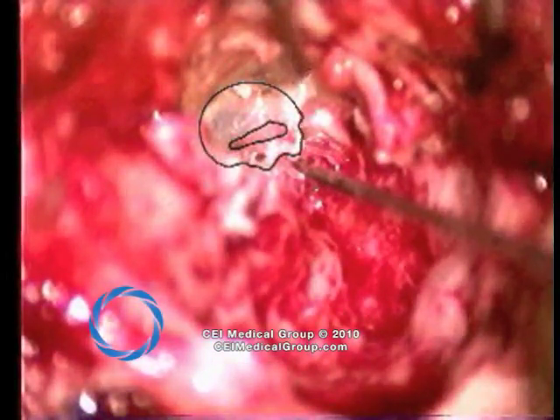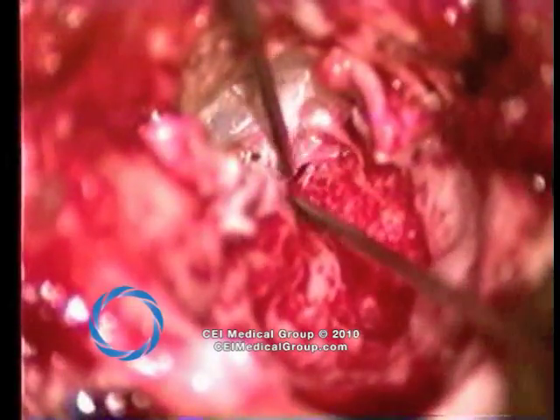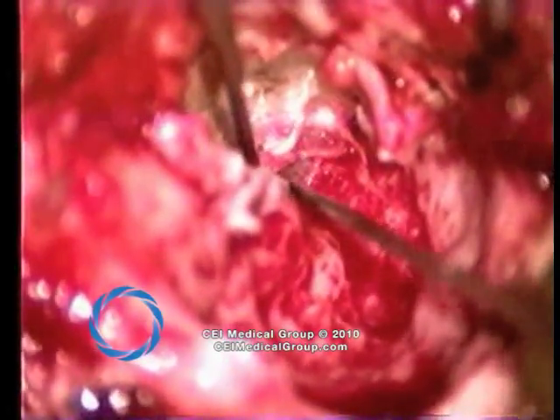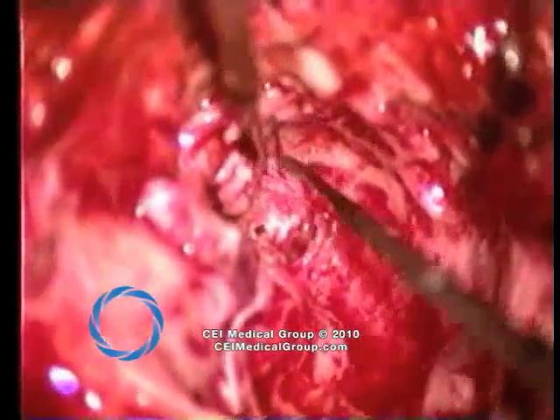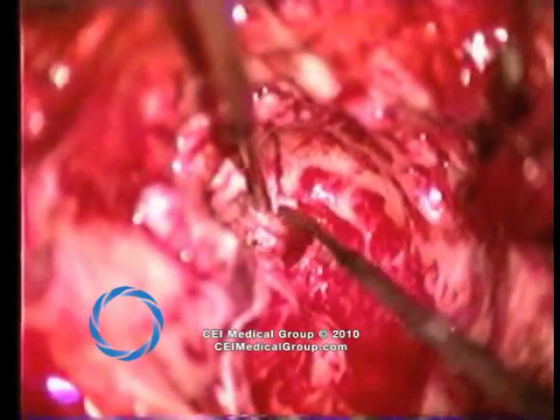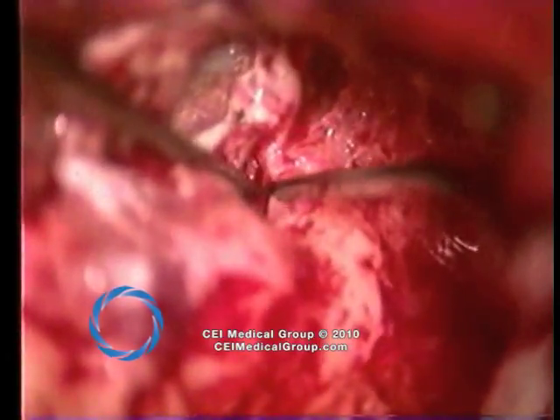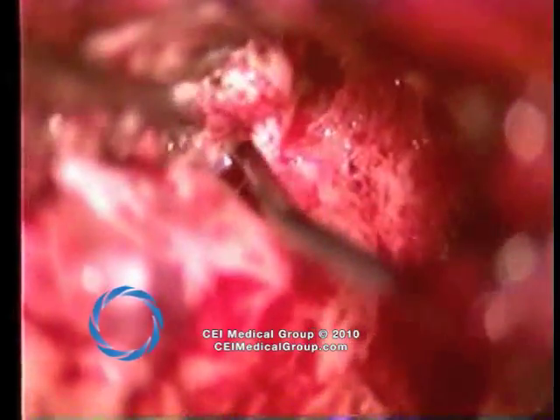The remnant tympanic membrane with enclosed malleus is visible. The head of the malleus has been removed, and the dissection is carried along the epitympanum at the horizontal facial nerve. In this case the middle ear space is pneumatized. The remnant tympanic membrane is elevated along the handle of the malleus and the short process of the malleus is exposed. In this patient, a large facial nerve dehiscence in the horizontal segment is demonstrated. Later, fascia and bone pate will be utilized to reconstruct the surface covering the nerve at this position.